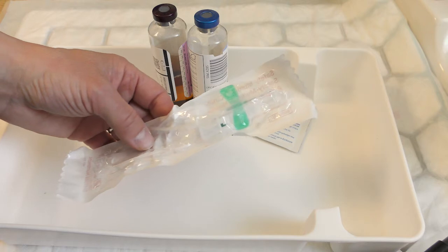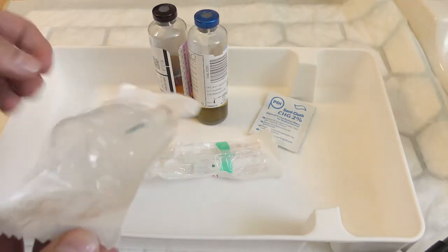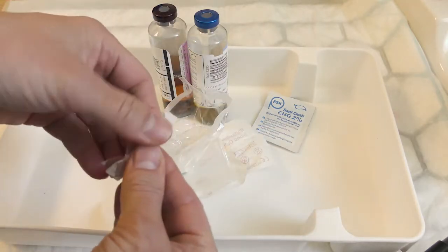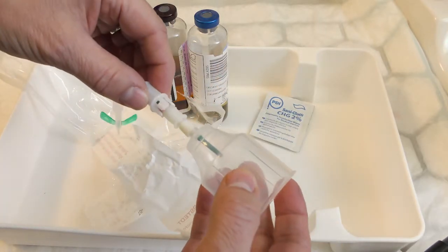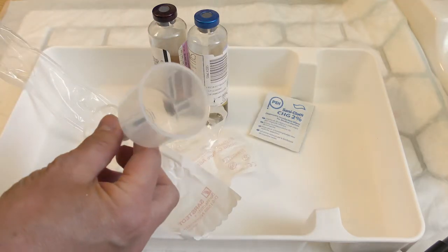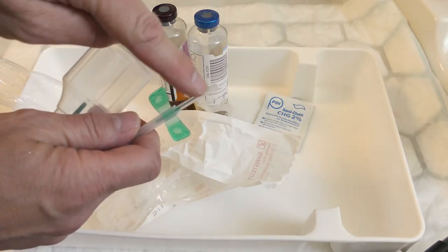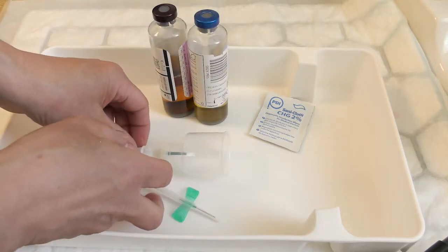Take the green 21 gauge multi-fly needle and the blood culture adapter cap. Open carefully and attach together. The key parts are protected — the needle inside the cap is protected by the cap, and it's covered in a green silicone sheet. The butterfly needle is protected by a plastic end cap. The packaging can be thrown away and this can be placed safely inside the clean plastic tray.